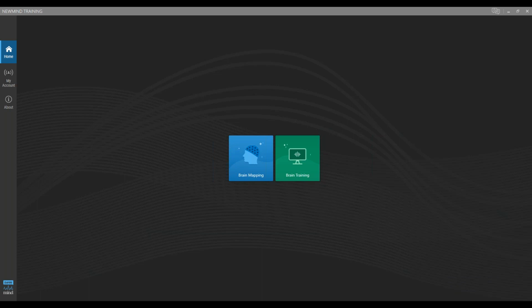And I think, Judy, you had a question to start with, right? We were wondering in the office about sometimes, you do all the things, you check the paste, you check the wire, you check it, and it still comes in a little crunchy on, say, one side, but yet the training efficiency is looking good. So we usually continue and go through it. But Aaron, I'd like your opinion on that and what you would do. Because usually I have one grown-up that it seems to happen to on one side for really no apparent reason. Doesn't matter the room. We've checked all the things you were talking about. But mostly it's with kids, the kiddos sometimes.